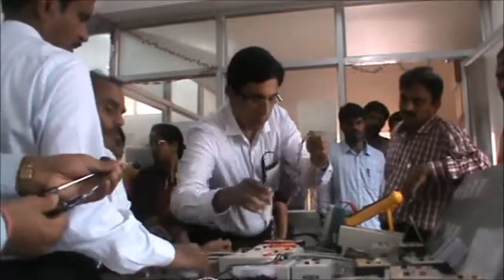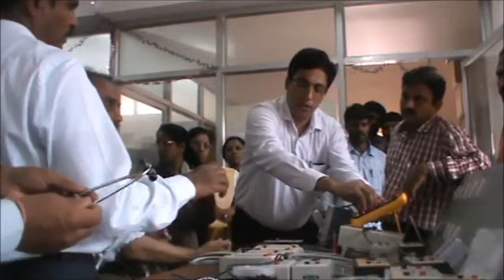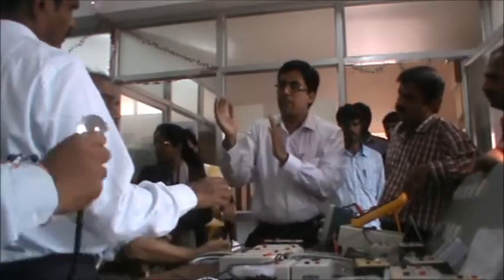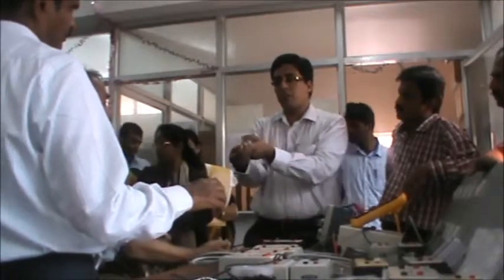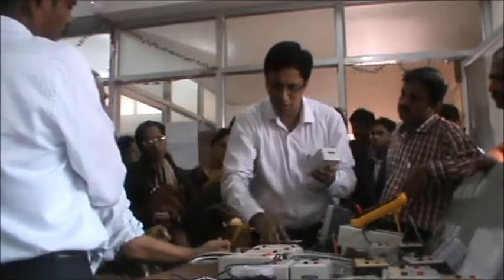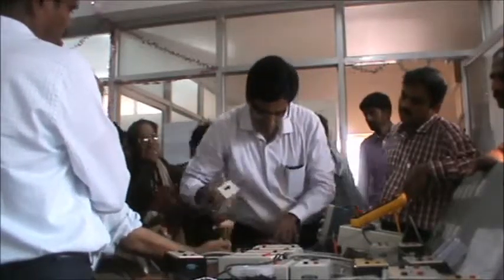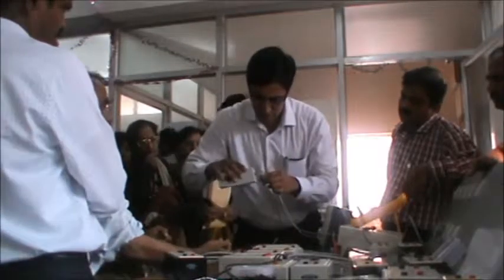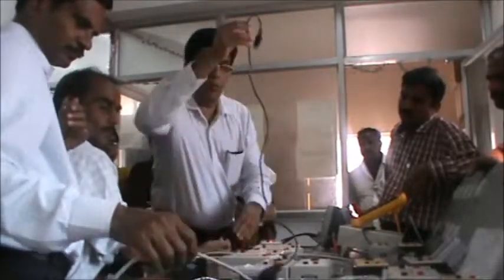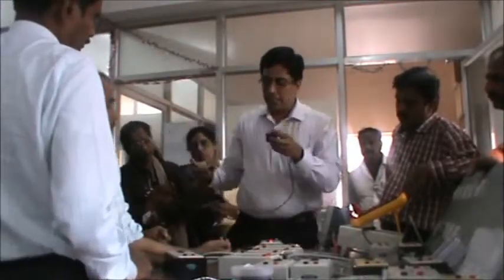Suppose if you take a peripheral pulse amplifier, you get the same beats per minute. Pulse rate will be slightly different from heart rate. Pulse rate we are going to pick up from the fingers. It is basically finger plethysmography, what we are going to do. So, I take the peripheral pulse. We have an LED and an LDR.